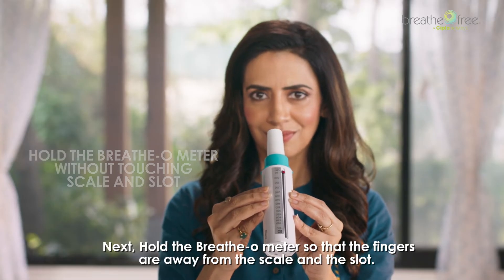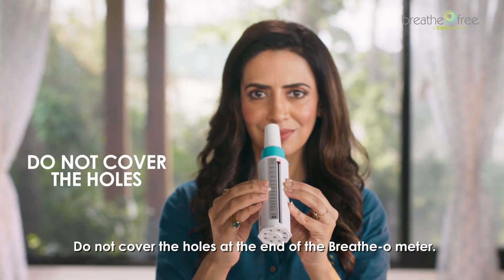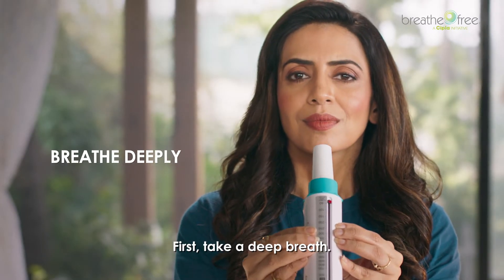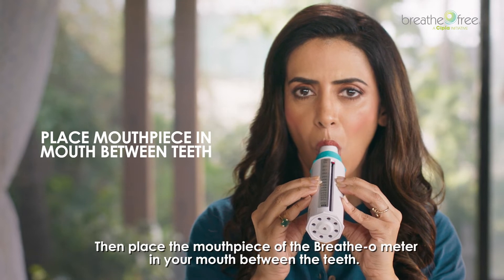Next, hold the breathometer so that the fingers are away from the scale and the slot. Do not cover the holes at the end of the breathometer. I suggest you take the reading while standing up. First, take a deep breath.